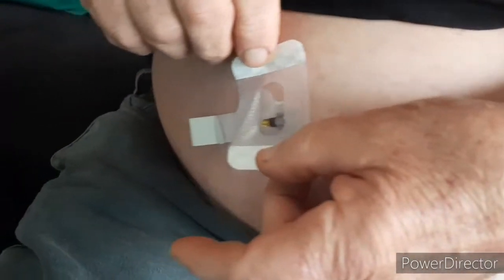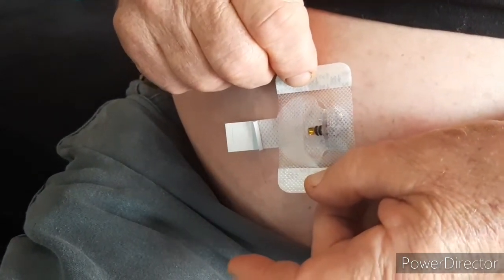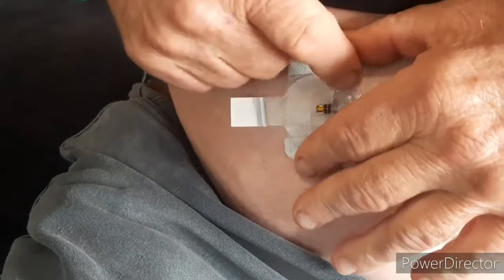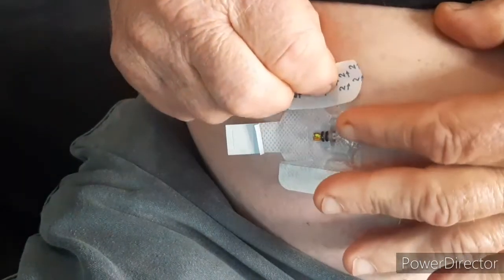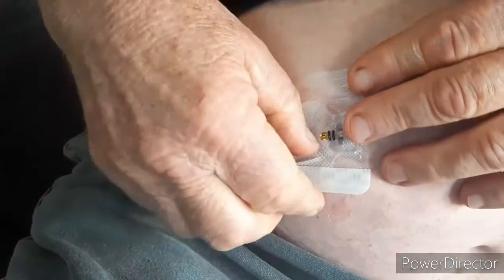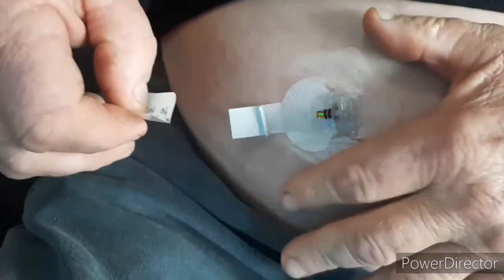Place the pad on the plastic mechanism, in front of it, and press it down to lock it. Then with the little tabs, pull out both sides and stick the adhesive down onto your skin.